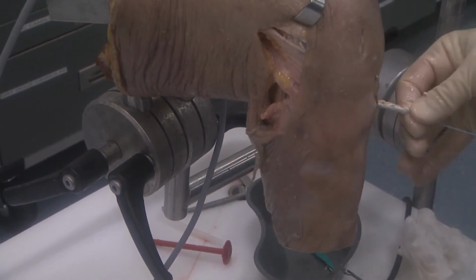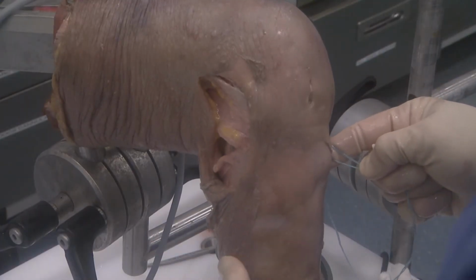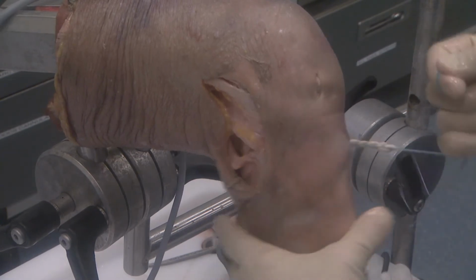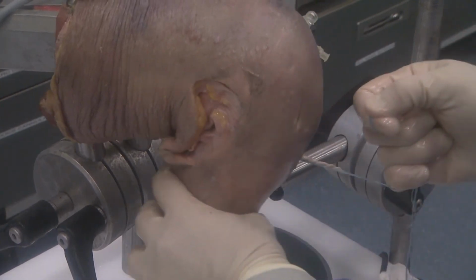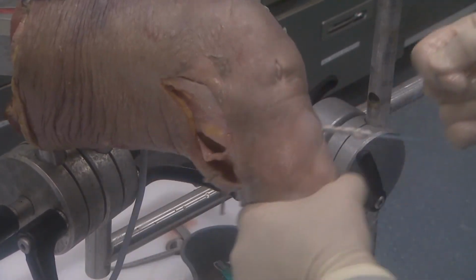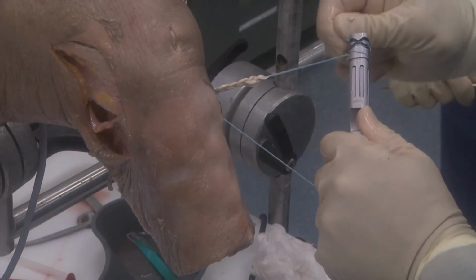To increase the stiffness of this construct, I like to fixate it within the fibular tunnel, and we're going to use a 5mm Tenolok to perform that. I want to get rid of the creep of the soft tissue before my fixation by putting tension on both strands and then cycling the knee through a full range of motion. Then I will place tension as I'm doing my fixation.